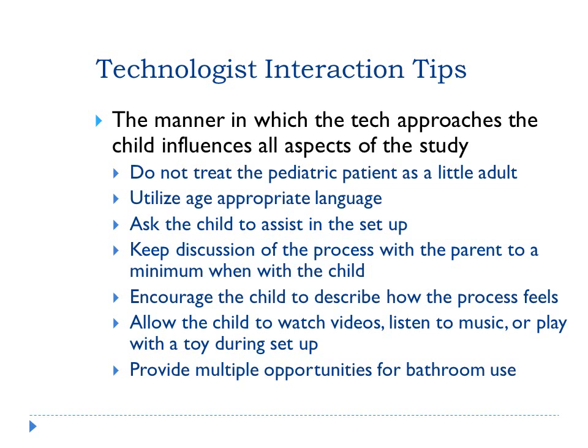Technologist interaction tips. The manner in which the tech approaches the child influences all aspects of the study. So you really want to make sure that your technologists are ready to interact with the age group. You do not want to treat the pediatric patients as a little adult. You want to use age-appropriate language, ask the child to assist in the setup, keep discussion of the process with the parent to a minimum. When with the child, you really want to be interacting with the child. Encourage the child to describe how the process feels. Allow the child to watch videos, listen to music, or play with a toy during setup and make it more of a game for them. Provide multiple opportunities for bathroom use as well. Let's go on to our next slide.